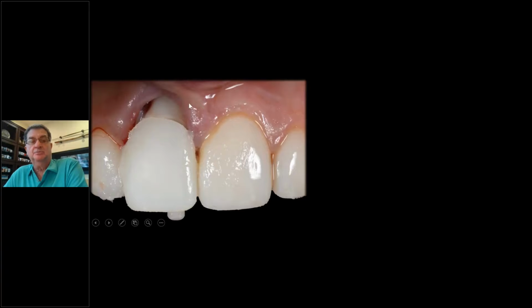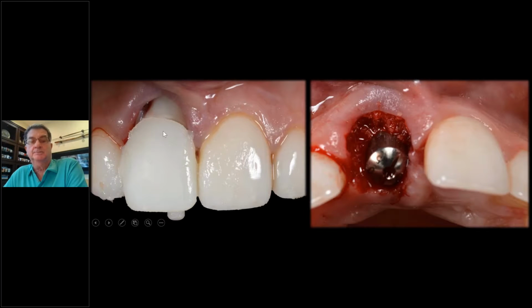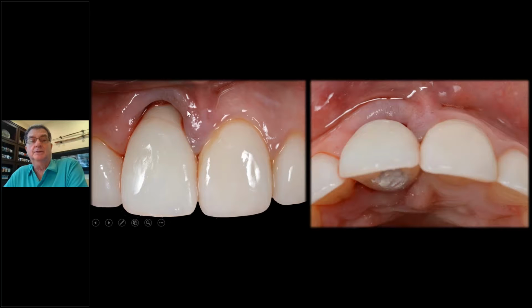So Steve made a flat profile temporary. Here it is starting to make it. And then we packed the graft in after he made the temporary. Dual zone grafting is still done. But we're going to under contour this. Here's the temporary. Look how flat that is up here.